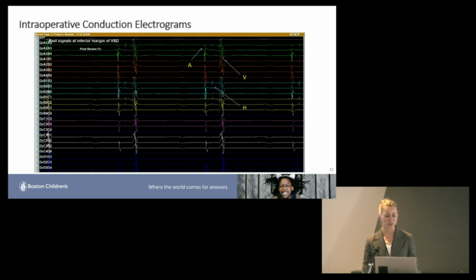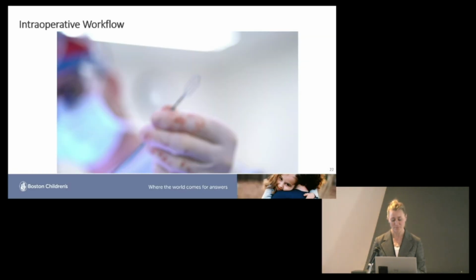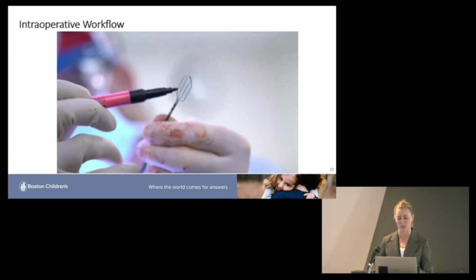And you can see that we get a lot of data in a hurry with that catheter, which is a 4x4 grid of electrodes. We see the atrial electrograms, the His bundle electrograms, and ventricular electrograms. I won't give you a test on this. And we're looking for the His. We're looking for that high frequency signal in between the two, the atrium and the ventricle.